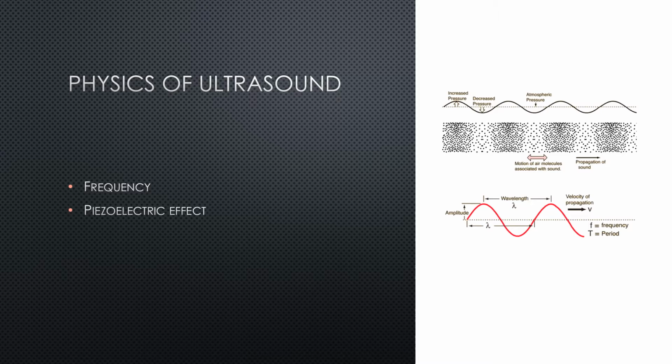The transducer itself functions through what's called the piezoelectric effect. That means that the ultrasound machine sends a pulse of electricity into the probe. The probe converts this electricity into a vibration of a crystal that then creates a sound wave. Then the machine shuts off the electricity. Some of those sound waves reflect back, and they cause the crystal to vibrate when it comes back. That vibration then creates an electrical current which gets transmitted up the wire back to the machine. So in this way, it uses the same effect both to create sound and then to create the electric signals that the machine interprets.